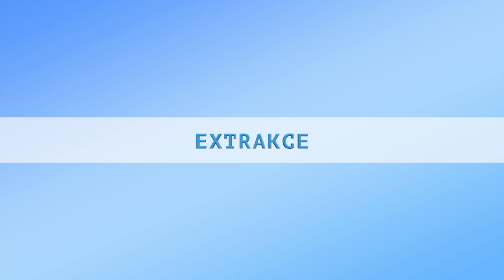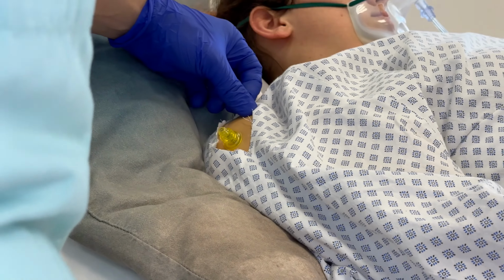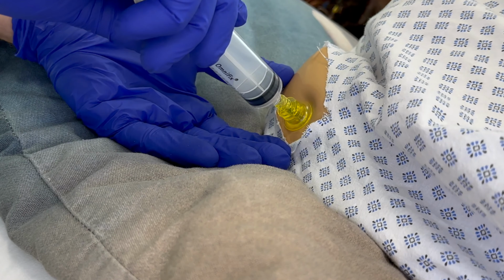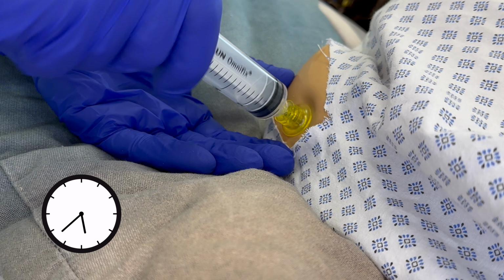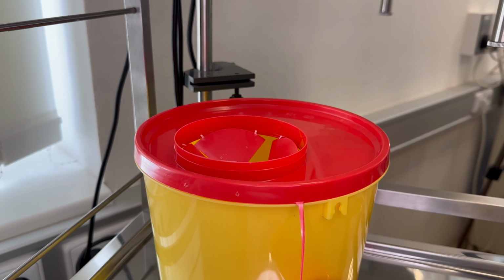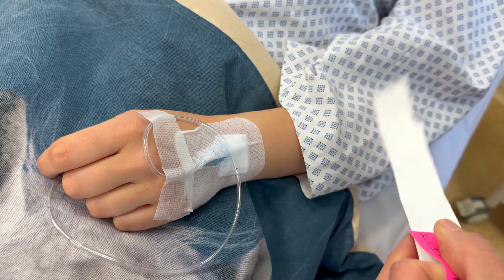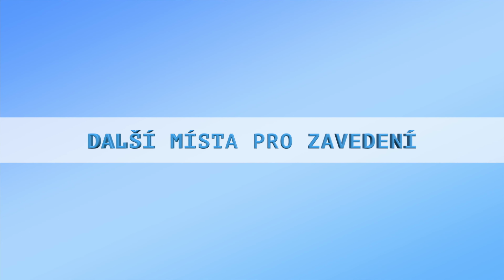Procedure for removal of intraosseous access. First, the extension tubing is removed. Then, the fixation patch is lifted and removed, and a luer lock syringe is attached to the end of the needle. Maintaining the correct alignment along the axis of the inserted needle, rotate the needle clockwise with the syringe while applying traction in the axis out of the bone. The needle must not be bent or tilted, as this may cause it to break. Once the needle is removed, it should be disposed of in a sharps container along with the syringe. The original intraosseous puncture site is then properly treated with local care.